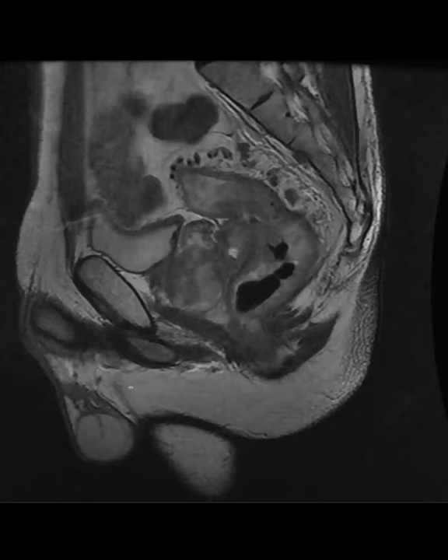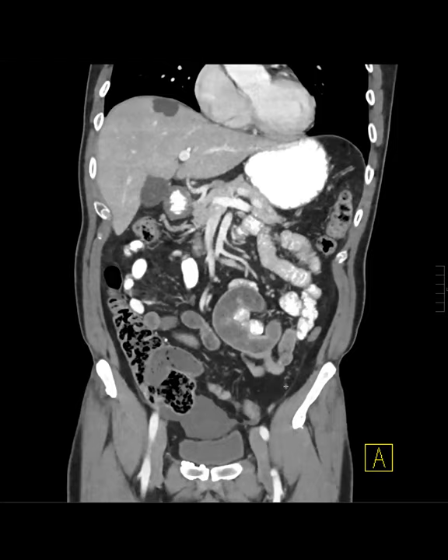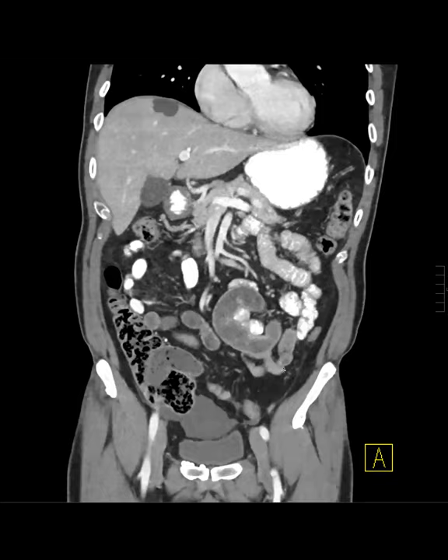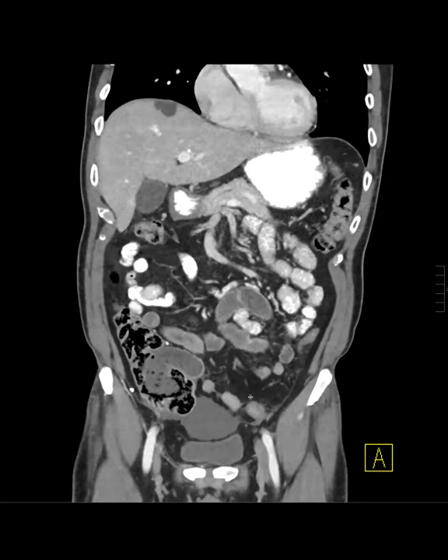Actually, Nelly, can you go back real quick? Let me go back. Just one thing I wanted to point out. This is kind of an incidental, but show me the TI. Yeah, so I feel like this is a beautiful example of the succus bolus of the small bowel going into the TI. And sometimes you don't see it all fluid filled like that, but you just see that fluid in the cecum, and people will call it a polypoid mass. And sometimes on MR, you'll see it too, like this T1 bright mass looking thing just in the cecum. And it's basically just the recent succus bolus. So anyway, just to point out. Awesome.